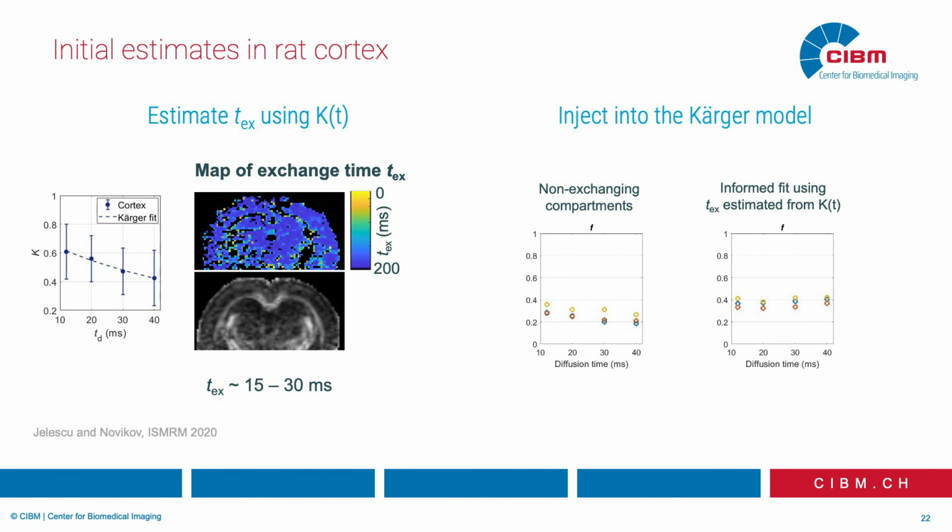And do you know whether in the estimation procedure here, the steps were in one dimension or in multiple dimensions? Because if parameters are correlated, you might be really trapped in some local optima, right? Yes, right. So we've actually looked at this landscape really comprehensively. I haven't shown it here, but we actually plotted the minimization landscape, and you indeed have, even around each of these two distinct minima, an ensemble of solutions that are highly probable that follow some kind of really narrow and shallow pipe. So then noise can actually make you travel pretty much anywhere along that pipe.